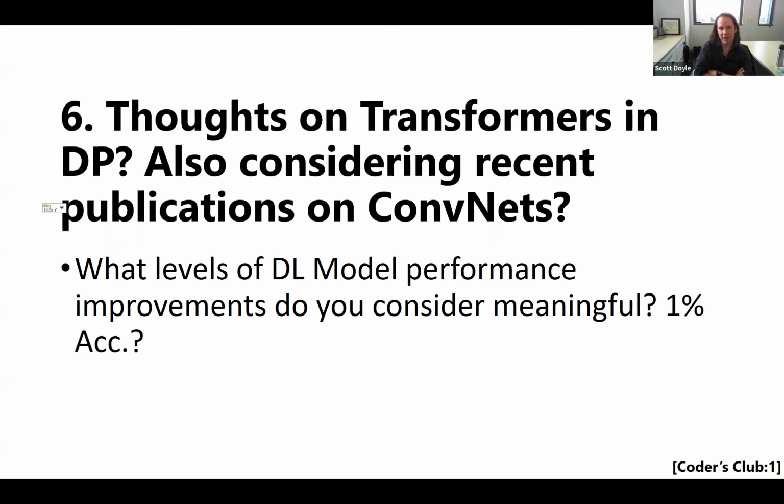You know, there's a branch of engineering that's focused on that. But in our world, it's like, okay, so am I still going to give this patient chemotherapy? Probably. It doesn't change the outcome, right? Going back to the question of impact and talking to your pathologists, if you bump your DICE coefficient of segmentation up by 0.01, those maps may look the same. It may not influence what happens to that patient.